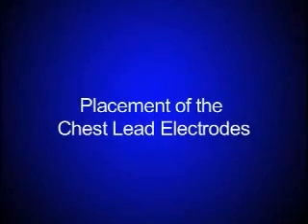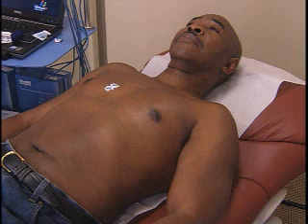Next is placement of the chest lead electrodes. V1. Place the electrode on the fourth intercostal at the right border of the sternum. V2. Place the electrode on the fourth intercostal at the left border of the sternum. V4. Place the electrode in the fifth intercostal space at the midclavicular line.